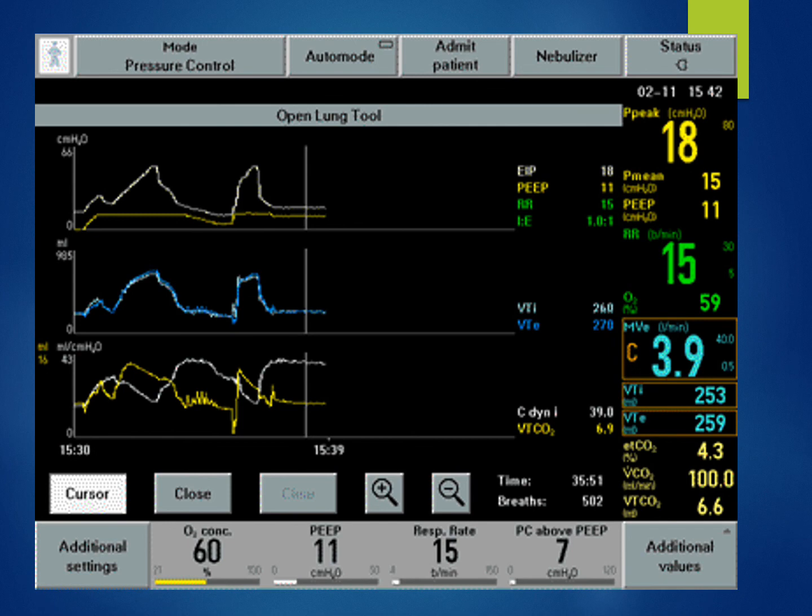So we talk about pressure versus volume modes. Can you see what mode this patient's ventilator is in? Pause the slide and then restart it to check your answer. So here you can see pressure under the title mode.